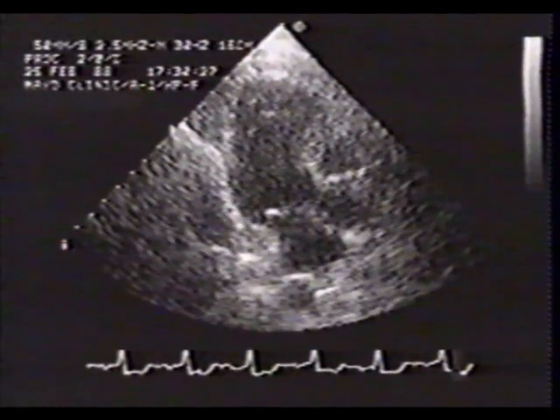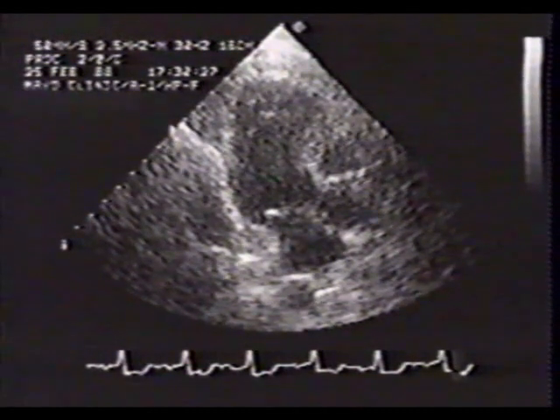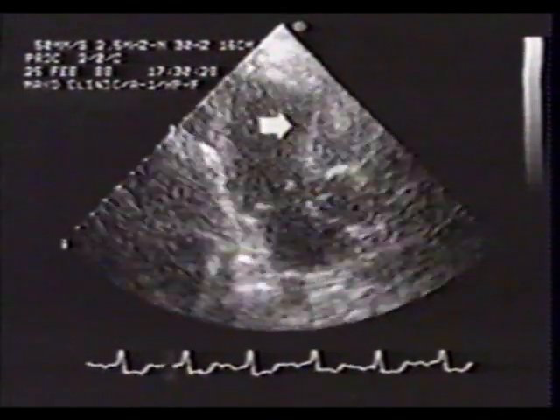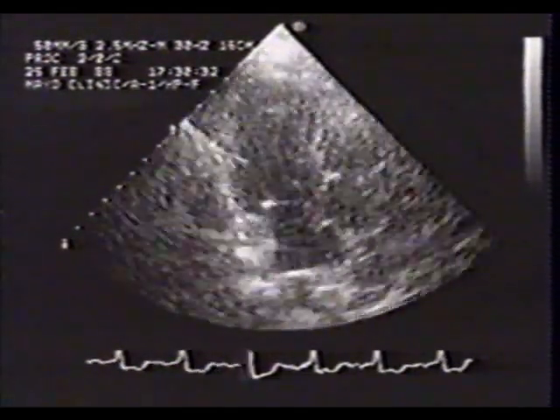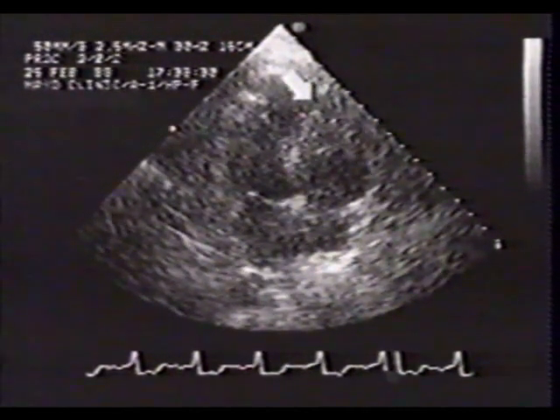This patient presented with an anteroseptal apical infarct and then deteriorated coincident with the appearance of a new holosystolic murmur. Surface echo was technically difficult, but on this apical long axis view, you will be able to appreciate the akinetic anterior septum. On the apical 4-chamber view, there was suspicion of a septal rupture near the apex.